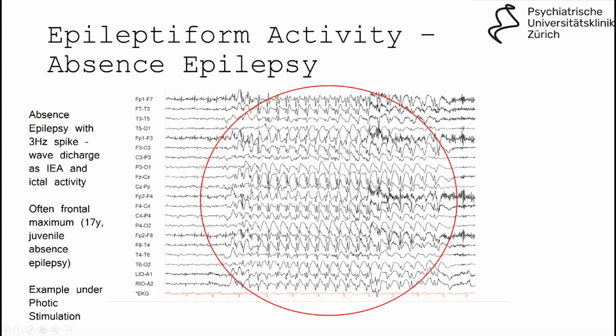As you can see here, this is a clear epileptic activity. This is not an interictal activity itself, because you see highly synchronous activity spreading over large regions of the brain. However, you can see, for example, in T3, T5, the activity is not that pronounced. There's almost normal activity, and only later it gets onto that activity. Also at T4, T6, the seizure activity is not that strong. That means it's not a generalized seizure, but it's only going on in some parts of the brain.